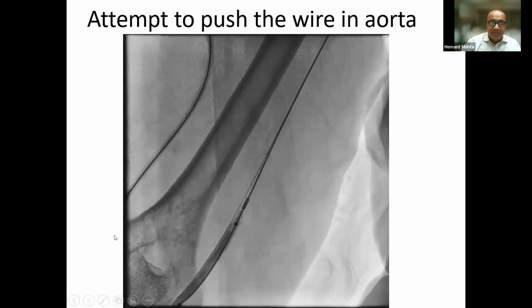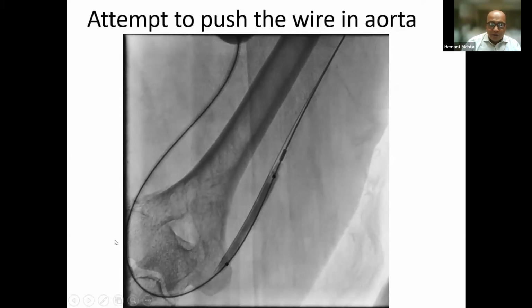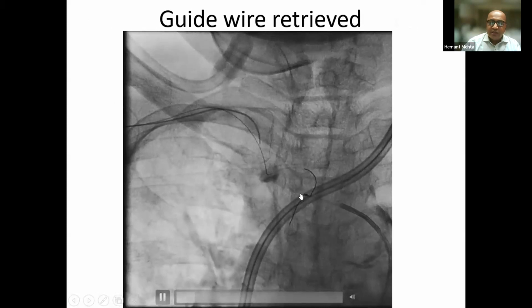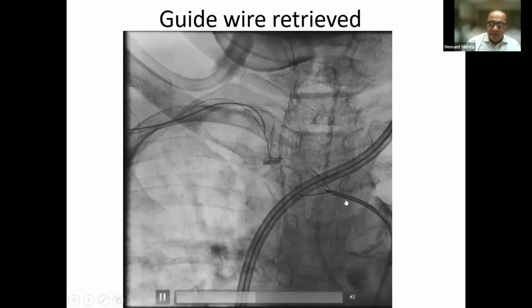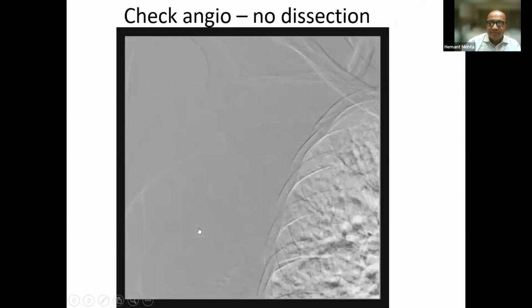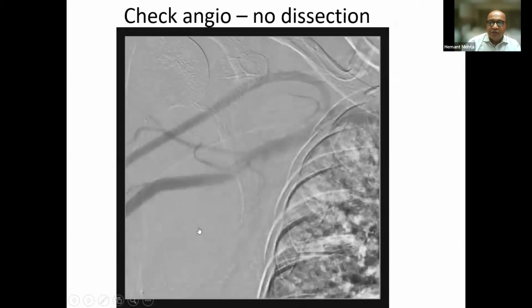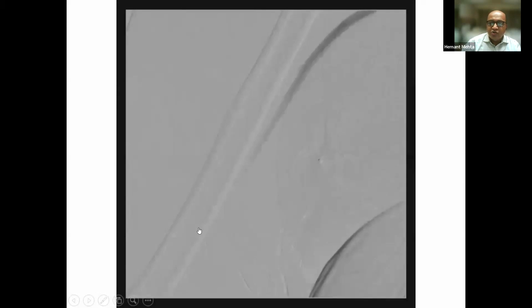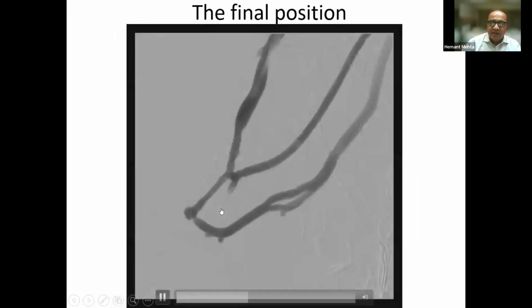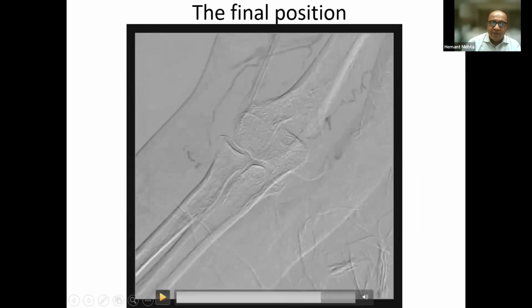So this has obviously not worked. So we took the same balloon and blocked this. Having blocked that, we went to the proximal end. So this is where it is. We came from here, put this, grabbed it, and then the whole wire was out. We checked the angio just to make sure that we had not caused any dissection on the arterial side, and the fistula was also fine.